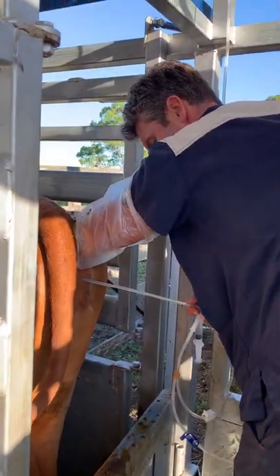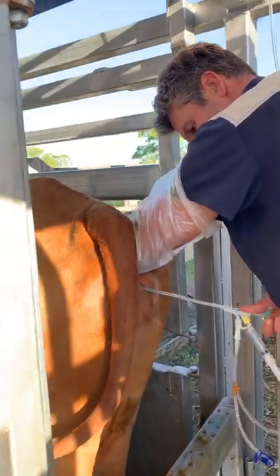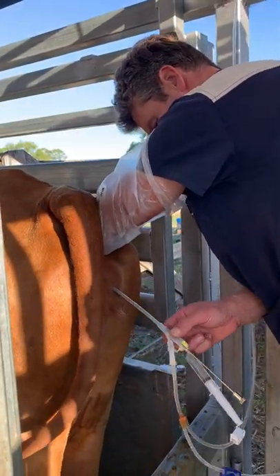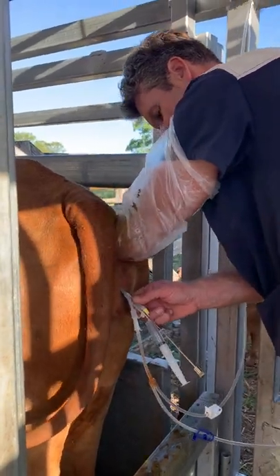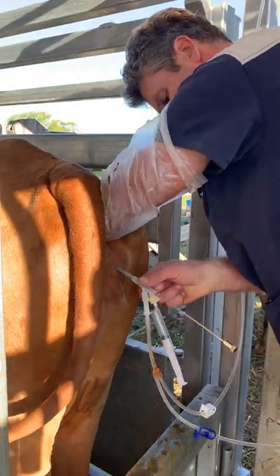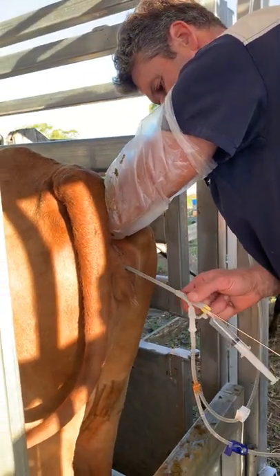Now I'm just over to the left side, so I go back to the bifurcation basically, and then I go to the left now, feeding the catheter to the left horn. Because it's quite sticky in there, the catheter tip will curl over, and so I've got to pull it back to straighten it and then move it. So it's sometimes a little bit of a process to get it to the front of the horn.